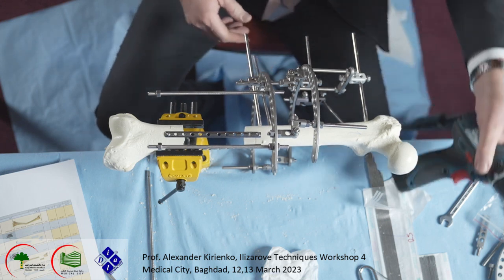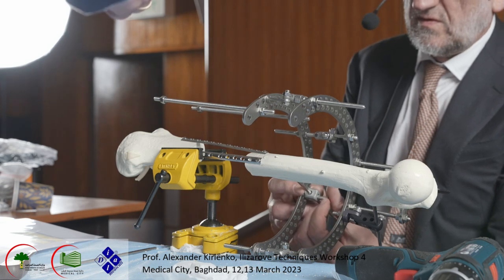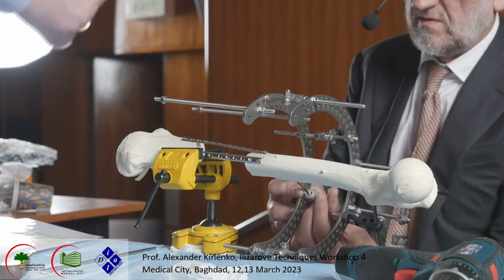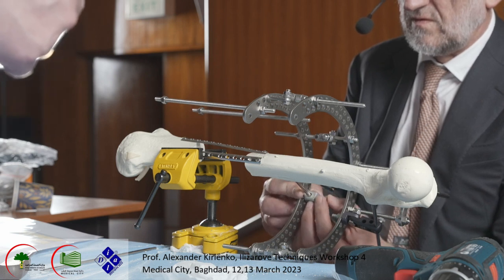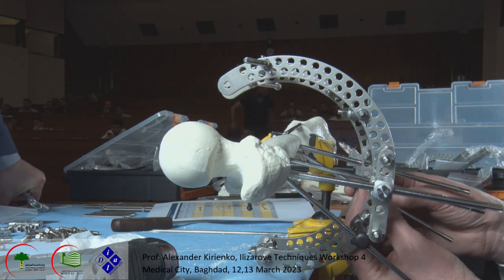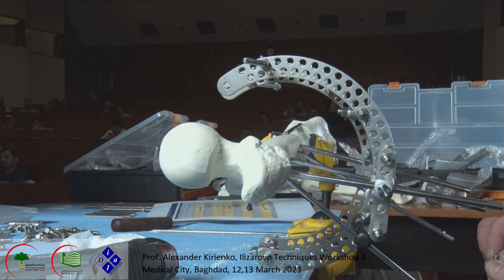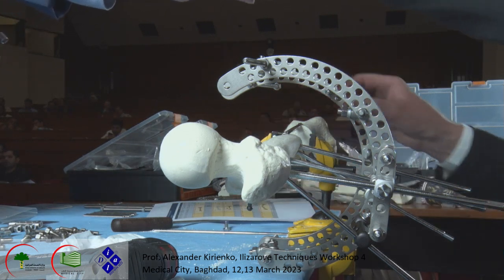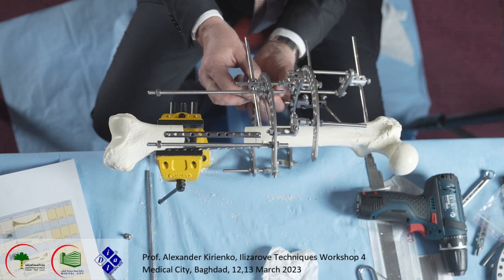Okay. Bolt. Not good. Well, let's use it, maybe just touch it. Okay.